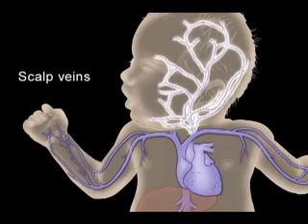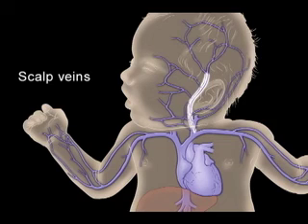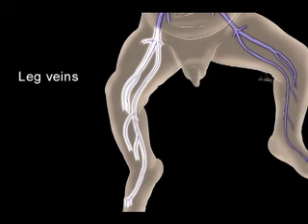Scalp veins are easily visualized but may become tortuous at the level of the ear and on entrance to the subclavian veins. Moving the head to a midline position during insertion may facilitate catheter advancement to the central circulation. Leg veins offer multiple sites for neonatal PICC placement, but it may be difficult to advance the catheter at the level of the femoral fold.